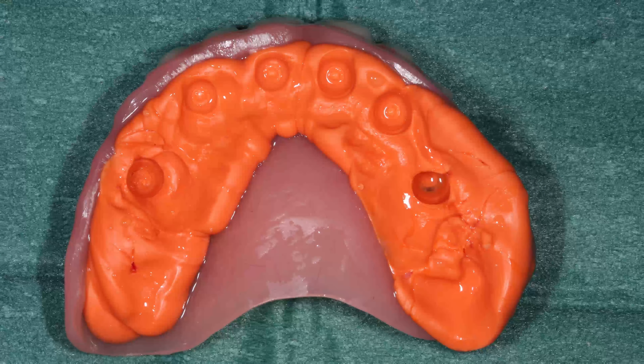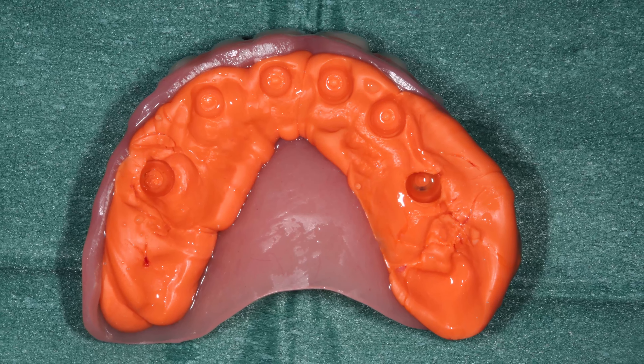So what could we have done differently to avoid this situation? The easy answer is we could have not given teeth on the day. Instead, what we can do is take molds and records of where the implants are, and then leave what we call healing abutments on all of the implants and send all of this work to the lab. The lab can then build much stronger temporary teeth, which we fit usually within the week. So it means we've got a few days with no teeth and these little metal things just poking out of the gum.